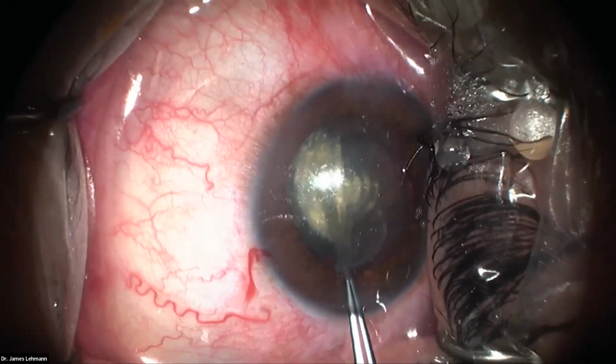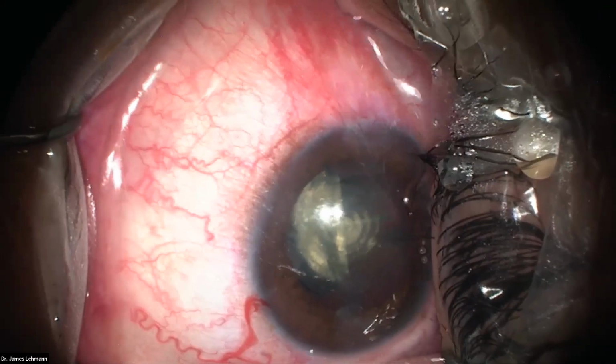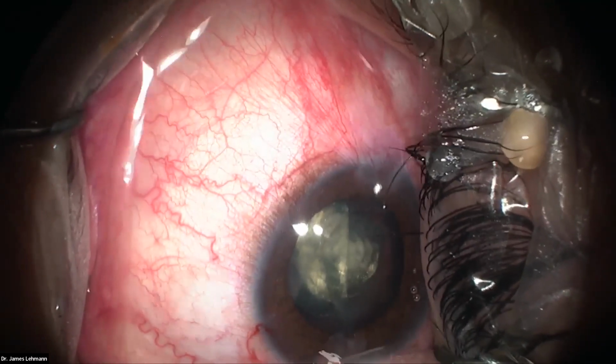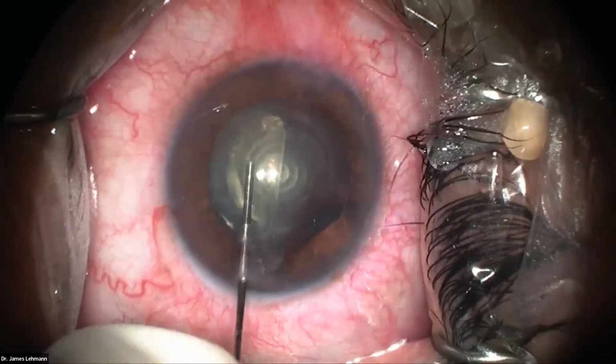And then I'm just going to remove it from the eye. There we go. And now we're going to do some, there's a little debris here on the cornea. I'm going to wash that away so y'all get a better view. And then we're going to do the hydrodissection now.